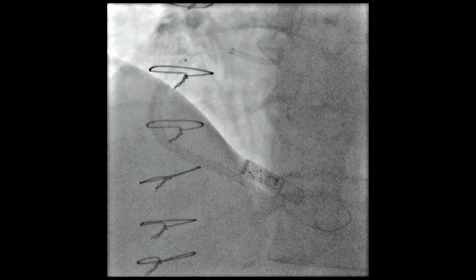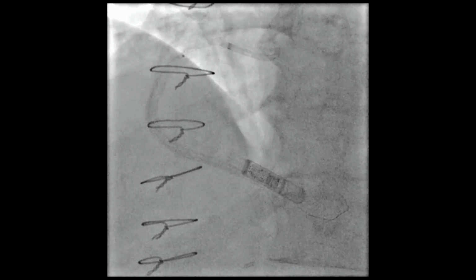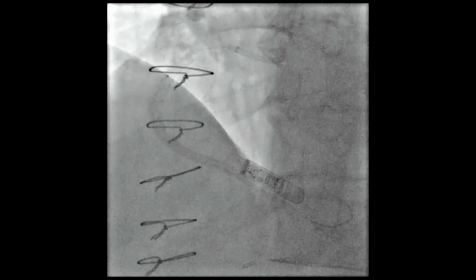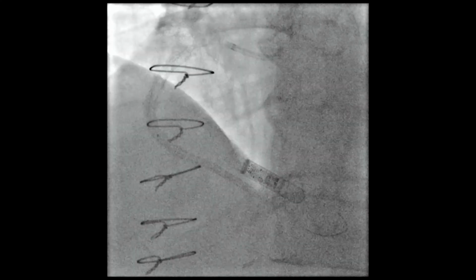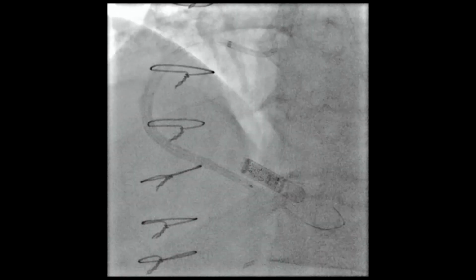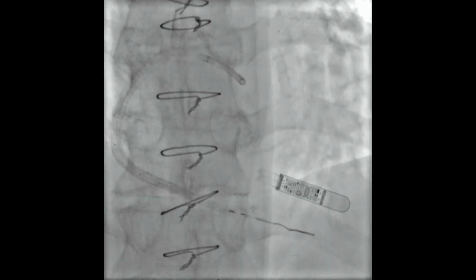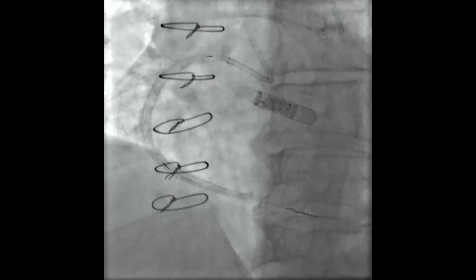Deliverability, back to Elias as part of the talk: guide catheter size, guide extension utilization, getting the support to get through all this is very important. So we used a 0.9 millimeter catheter at 80/80, the maximal output, all the way down through the vessel, and then performed PTCA of the vessel with a 1-to-1 sized scoring balloon all the way back, and then performed brachytherapy. Distally gave 18 gray, proximally gave 23 gray.